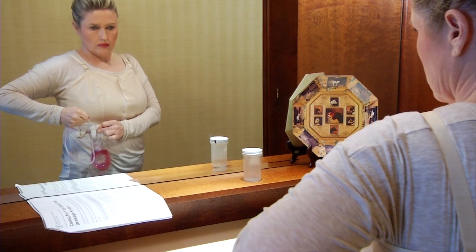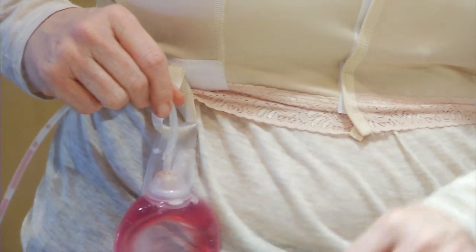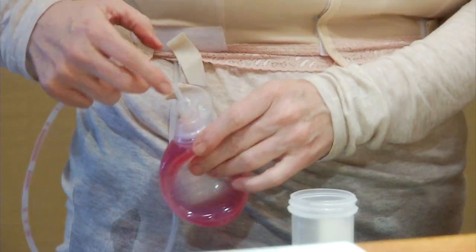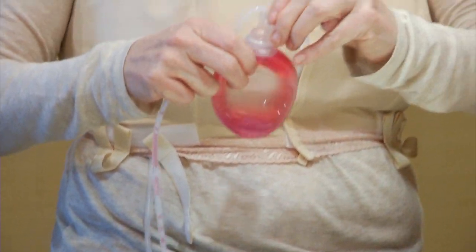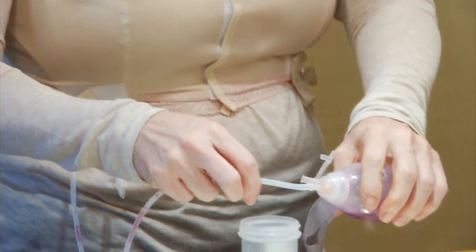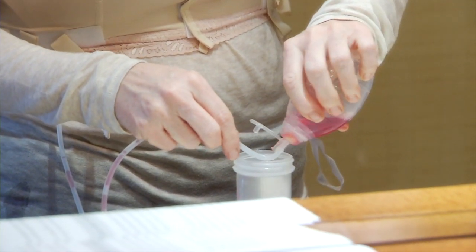Once all the clots are in the bulb, you're ready to empty it. Unplug the stopper. Then turn the bulb upside down and gently squeeze it, pouring the contents into the measuring container.